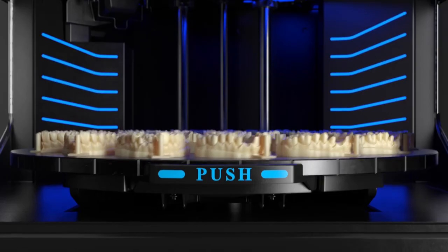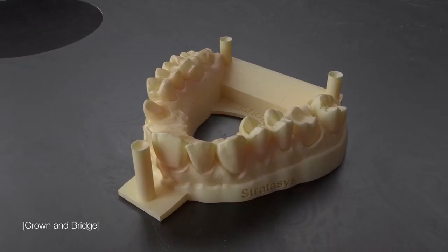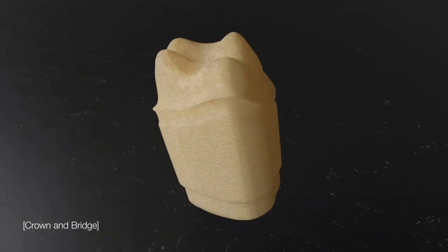Increase your lab capacity, eliminating the delays and inaccuracies of manual labor, with large volumes of exact crown and bridge models printed in high resolution materials.